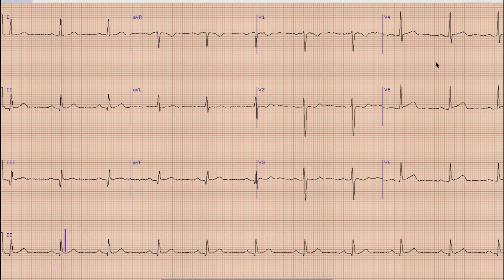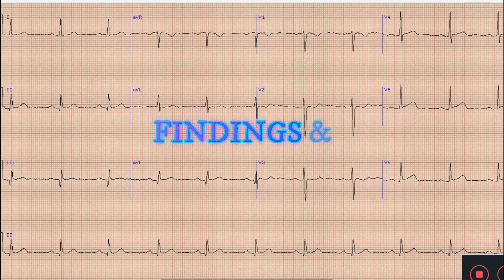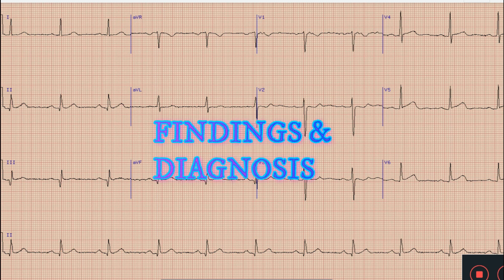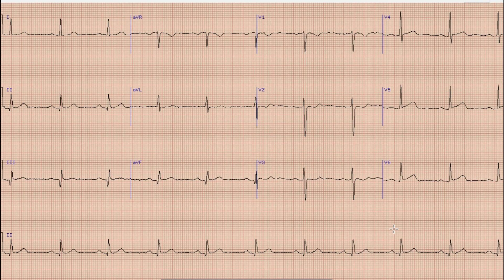This is the ECG which we are going to discuss today. As always, another interesting case. But before starting the discussion, I would like you all to pause your video, note down the findings and diagnosis, and at the end of the video compare your findings and diagnosis with what was discussed in this video.